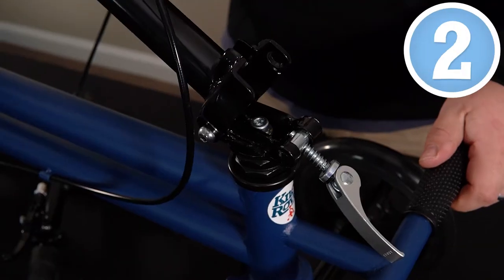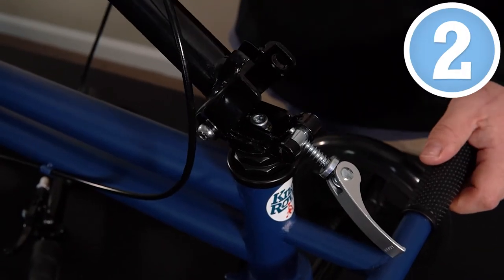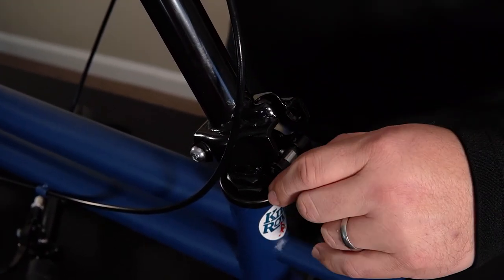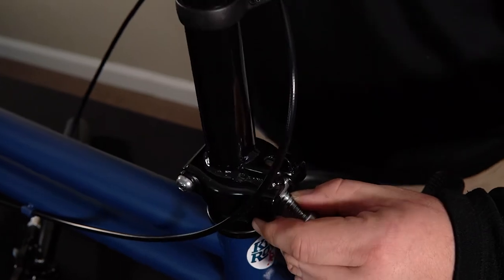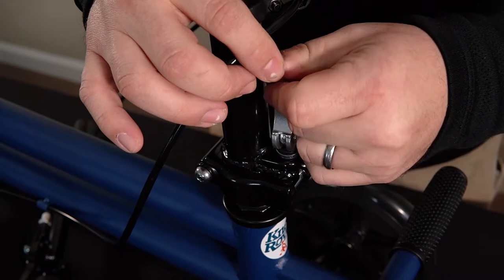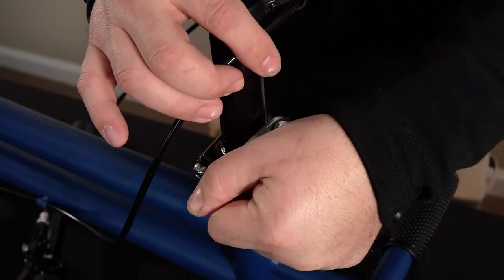Alright, so step number two, we're going to rotate the steering column up and lock it into position by pulling this quick release lever over, and then releasing, and then we're going to rotate this lever upwards into this groove, and then clamp it down.